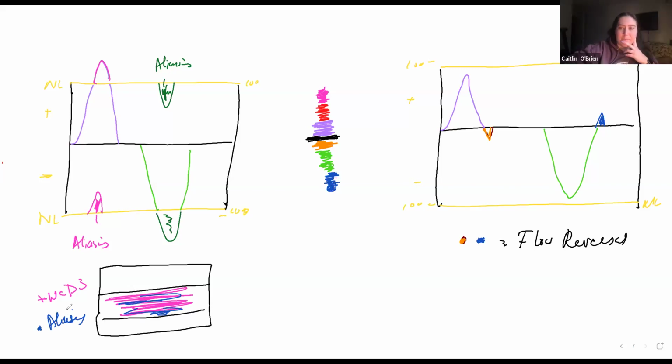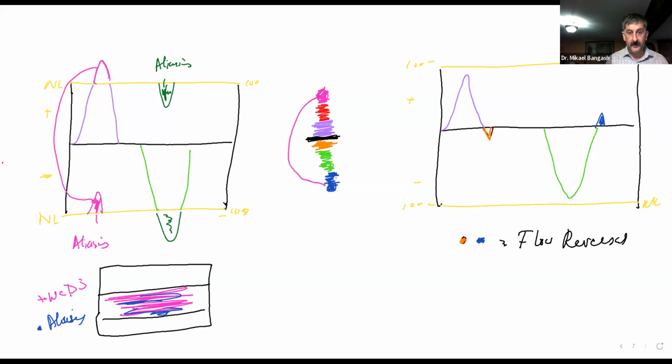So when you look at the aliasing, whether on spectral Doppler or on color Doppler, this became evident here. This color here, which should have been this, gets represented by this.